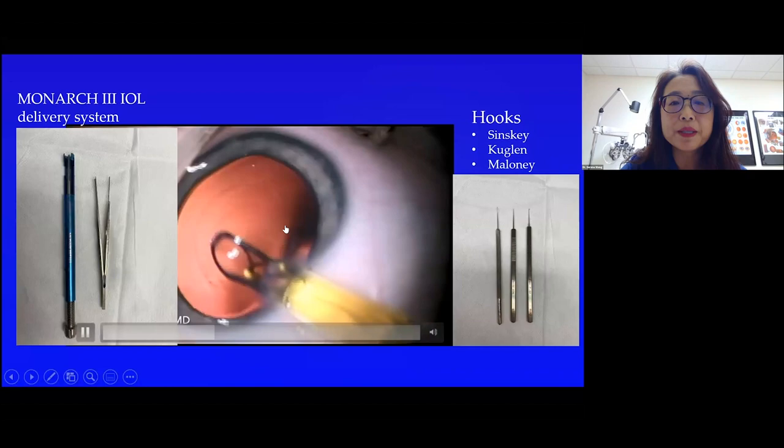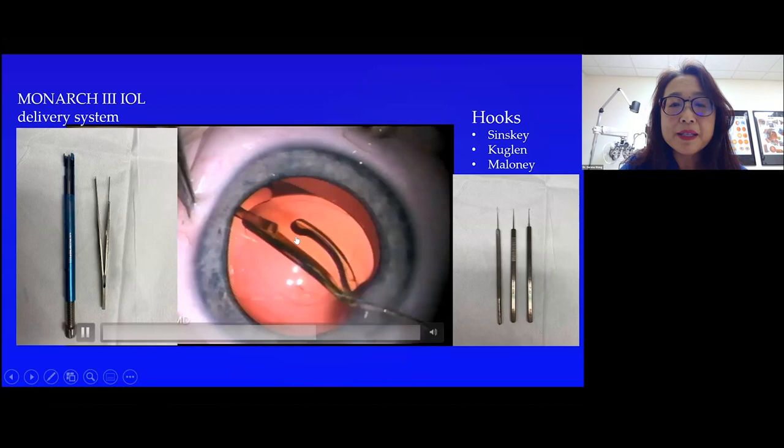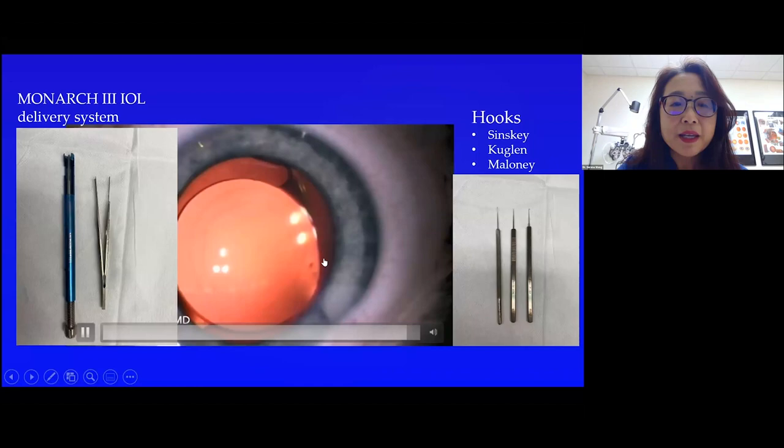After I fill up the bag, I have anterior and posterior capsule both open, but you want to inject this lens in the back. The key is you lift up your tip. You don't dive your lens into the vitreous. You actually lift the tip up and put it in the back. One good thing about this Alcon lens, it's acrylic and so soft, it opens up very slowly. You do have time to position it.